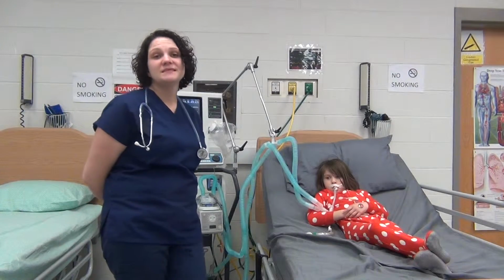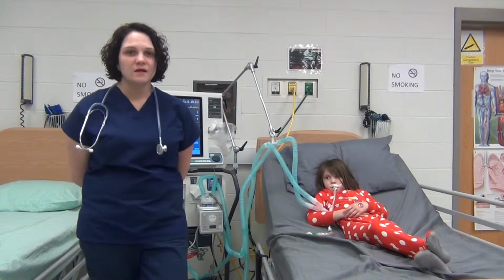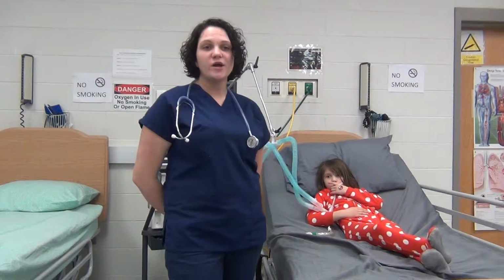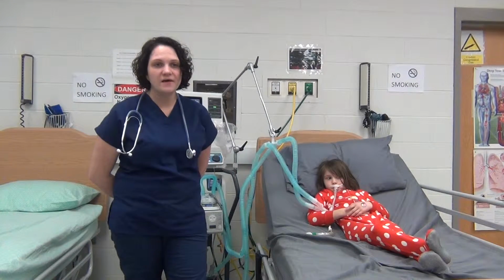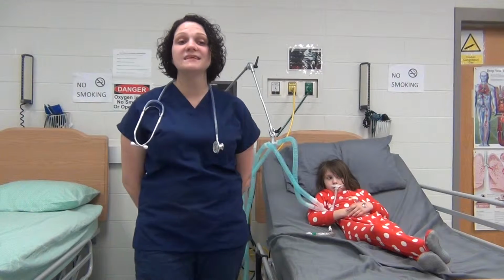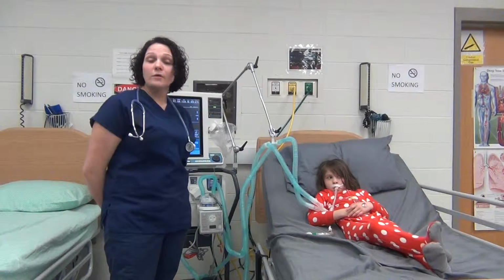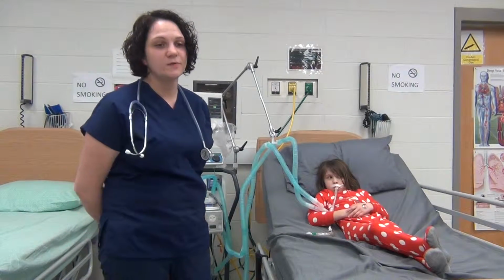I'm currently working with Mrs. Tubbs in the management phase of mechanical ventilation. Mrs. Tubbs' typical COPD arterial blood gas is a compensated chronic respiratory acidosis with mild hypoxemia. Her last gas values are pH of 7.36, a PaCO2 of 79, a bicarb of 43, and a PaO2 of 61, which is a stable arterial blood gas for this patient with emphysema or COPD.